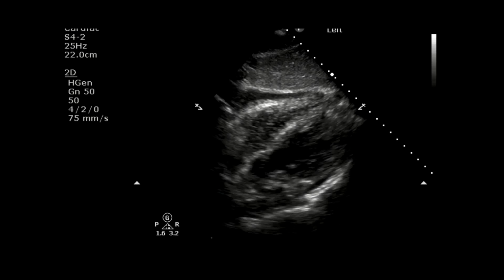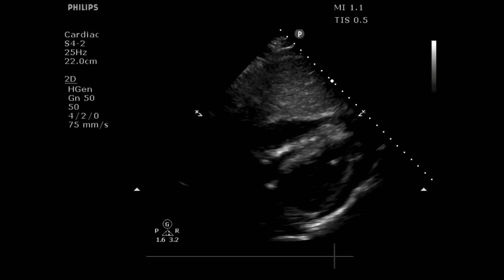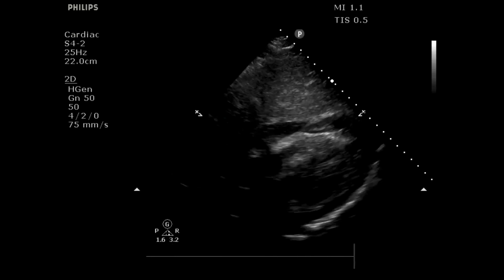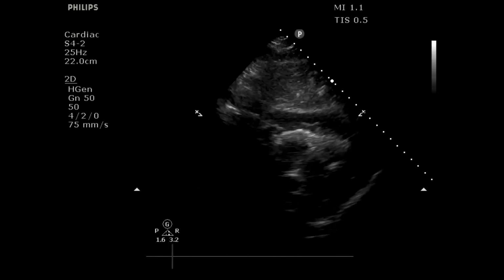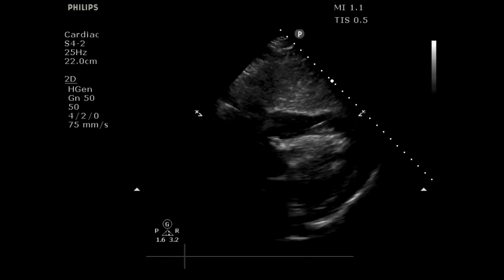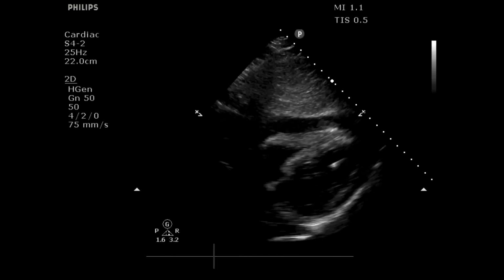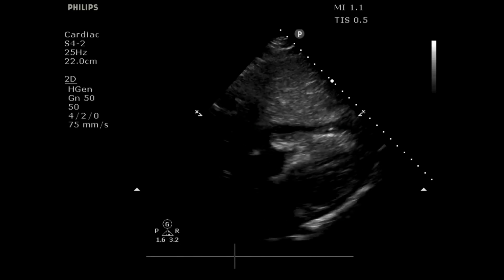So there's a little bit of time delay, just with some logistics of getting the proper people in the room to evaluate this patient. But we basically were able to watch over the course of a few minutes and see what happens as that effusion collects a little bit further. And what we see here is that effusion's a little bit larger, but we see a little bit more compromise of that RV chamber in diastole.